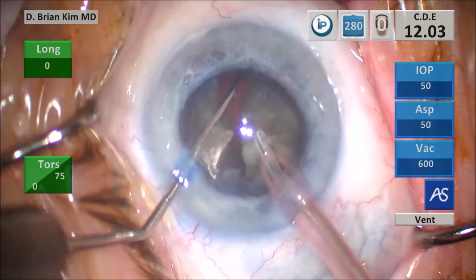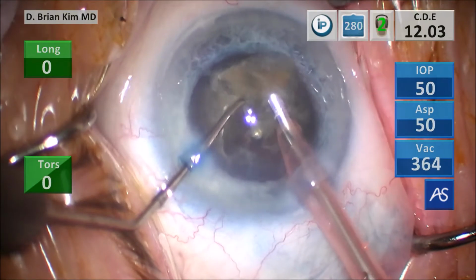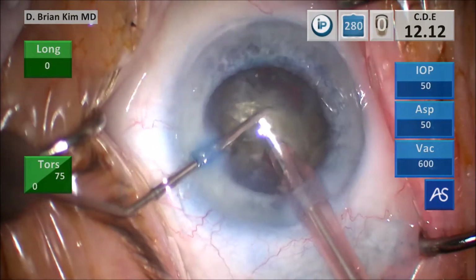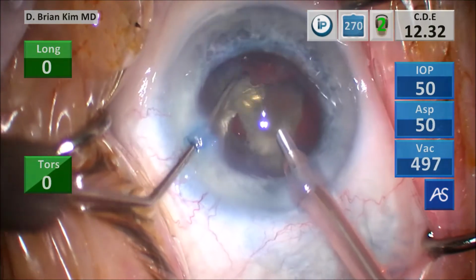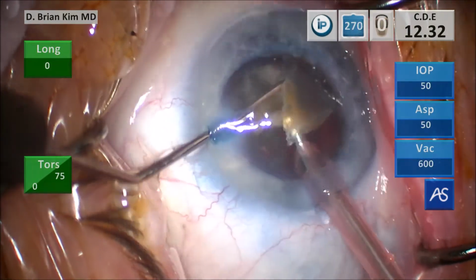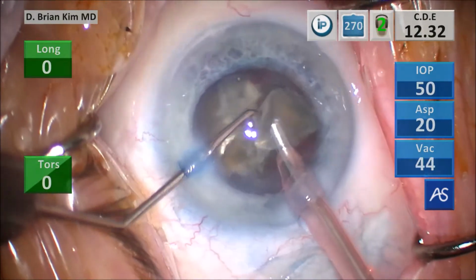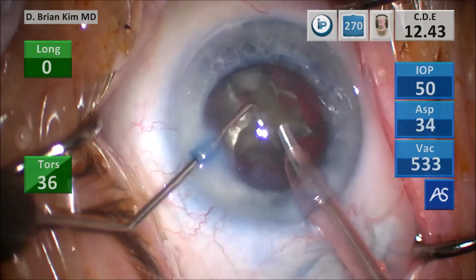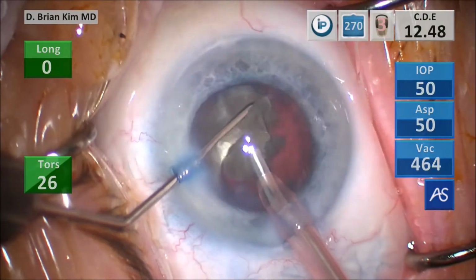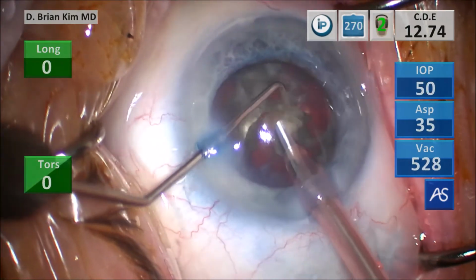Using some vacuum to lift that first piece up, chopping the posterior aspect, that was a scissoring chop maneuver, amputating that piece and turning the chopper sideways. Using some vacuum to grab that piece up, again fracturing the lens between the instruments, and then emulsifying the lens pieces. Again, utilizing mechanical fracturing to break the pieces into smaller and smaller pieces decreases your risk for wound burn as well as post-occlusion surge.